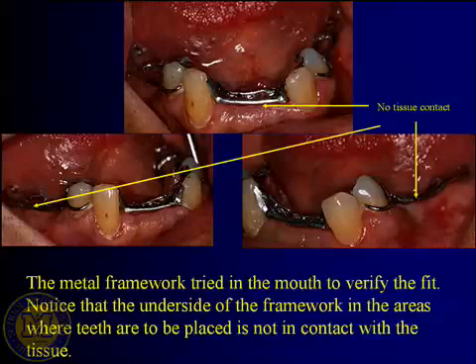And you may or may not know, from the time you get your master cast impression that you're going to make the lower partial denture framework on, have it poured up and have a design cast all made, and send this off to the lab, it takes the lab approximately 2 weeks to get your framework back to you. So if you're dead in the water for 2 weeks anyway, waiting for the framework to get fabricated, can you see if you're doing a combination case, first make sure you get the arch that needs the partial denture all set to go. Get the master cast done and send it off.